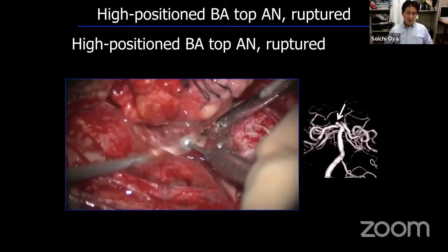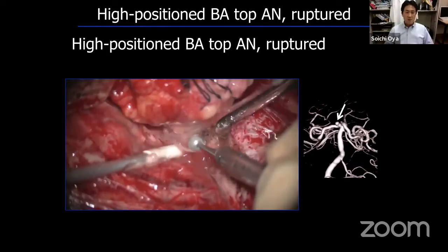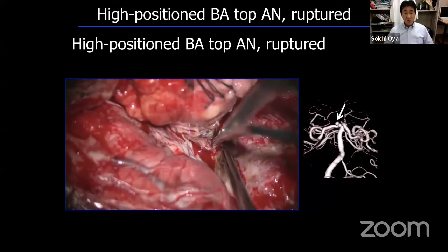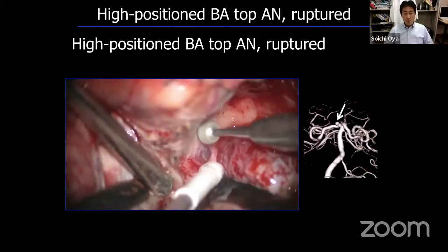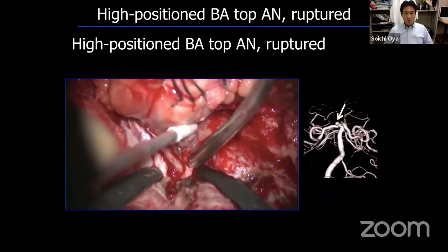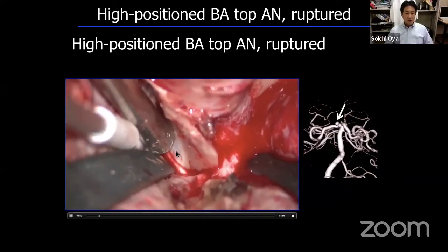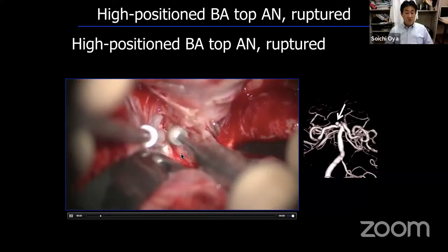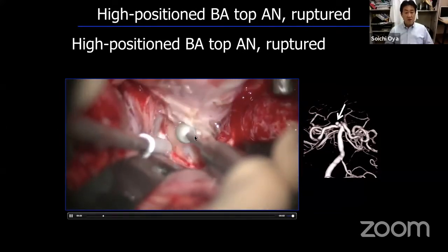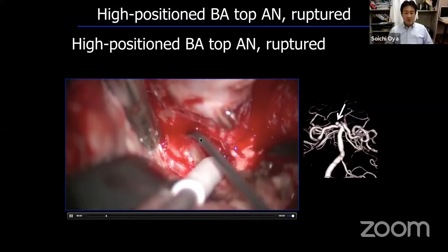So we utilized the orbitozygomatic approach, and the macroscopic part was already done. This is a right-side approach, and I'm cutting the meningo-orbital band. I'm also drilling and opening the superior orbital fissure. Look here, the optic canal roof is extremely thin. Sometimes we encounter this type of optic canal, and we just added a slight drilling of the optic roof.